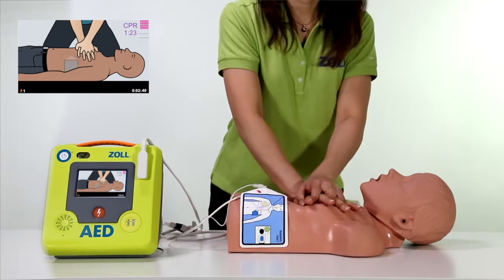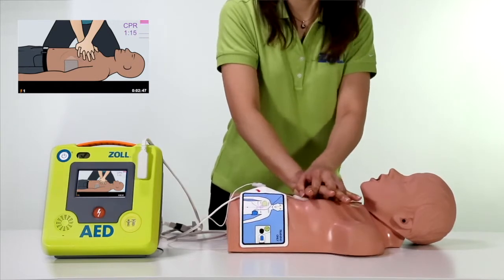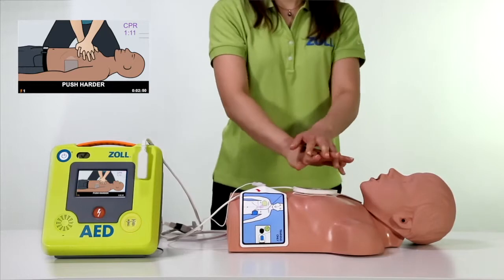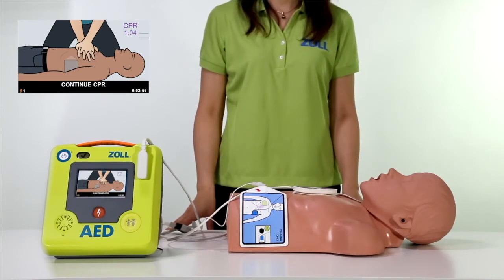It's common for rescuers to tire as they do compressions. If compressions are too shallow, a voice and text prompt will indicate to push harder. If you stop compressions, the Zoll AED3 can see this and will prompt you to continue CPR.